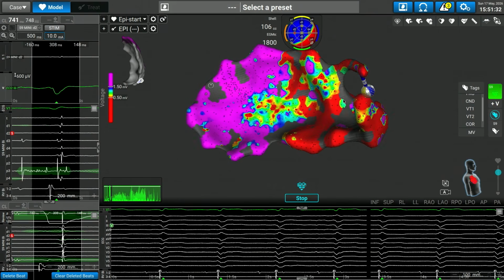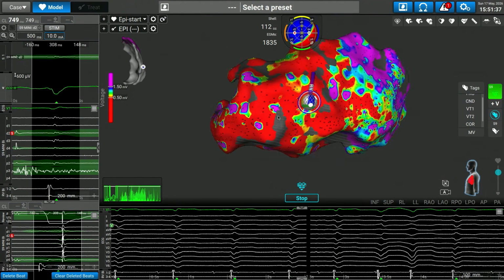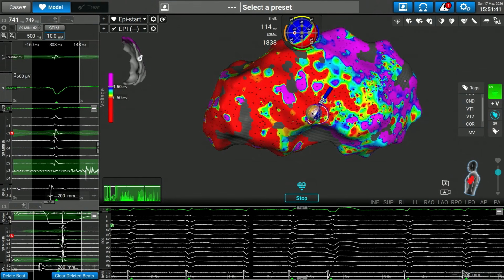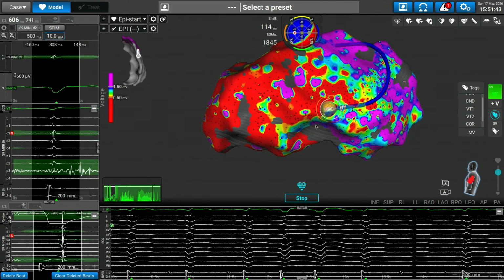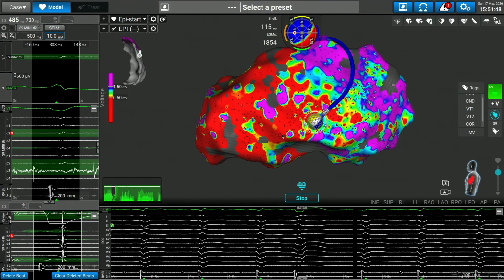Well, activation mapping, I don't know what your feeling is. The activation mapping, we've been pretty disappointed with it with the Affera system. I think activation is tough with the system, especially endocardially. But yes, particularly on the endocardium, we were tagging potentials that were interesting.